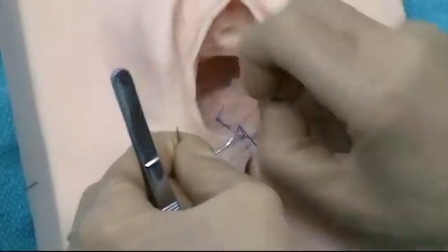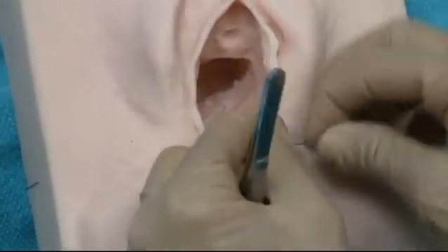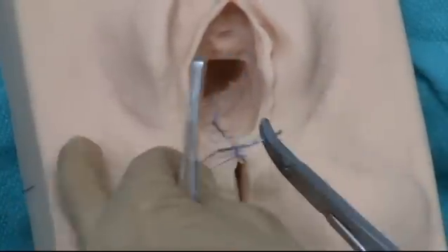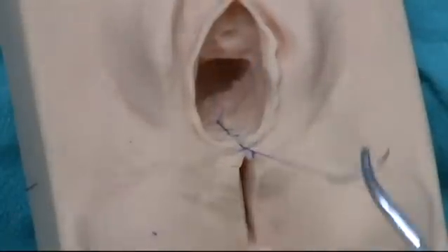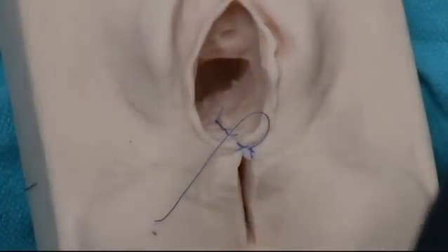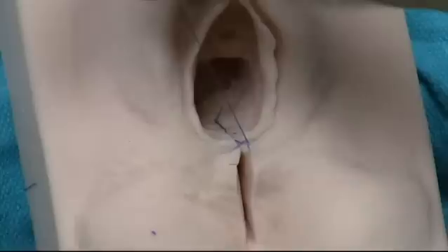There's one loop and I slide it through and pull, then bring the rest of the suture material through the second loop and snug it up. You'll see how that gives us a good knot but with less suture material. I'm going to cut that because we're going to tie off our whole repair to that knot at the end.